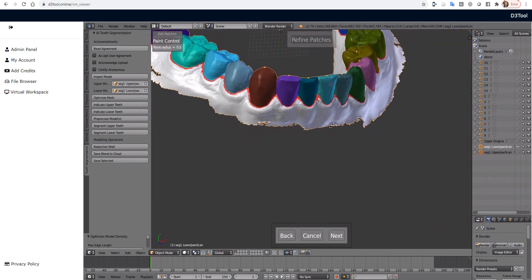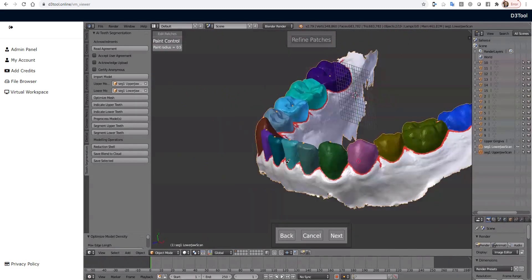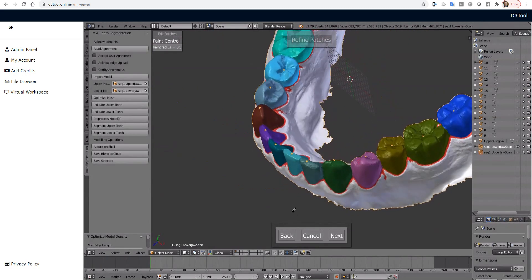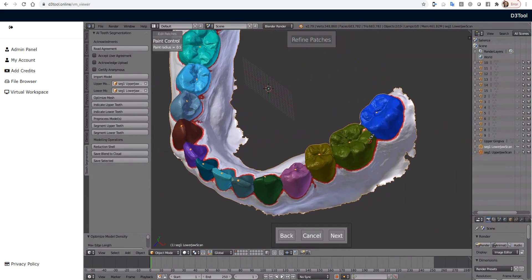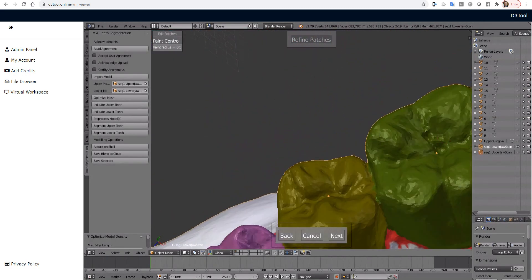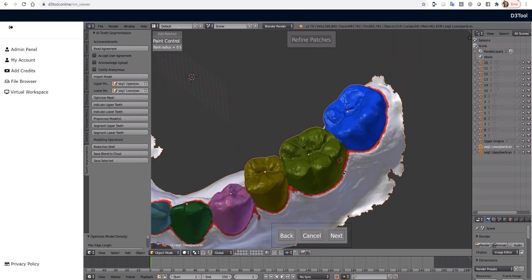Great. So now all of our lower teeth are segmented, this little area here that we missed. Not a big deal. Left click and paint. And we could also probably get away without even bothering with that. Again, 10 out of 10.